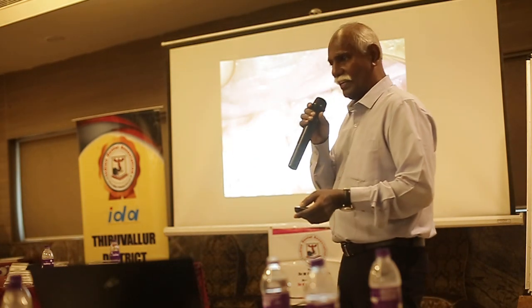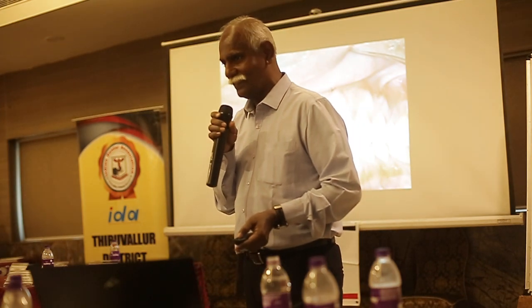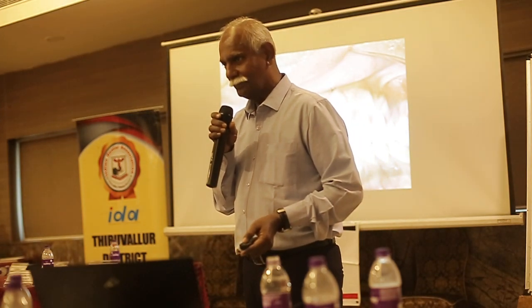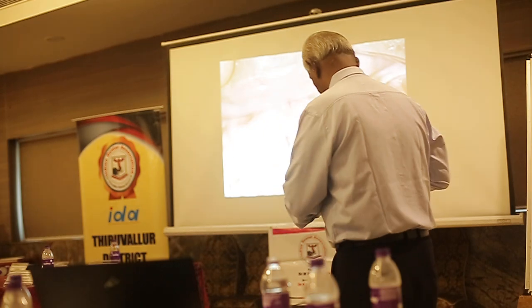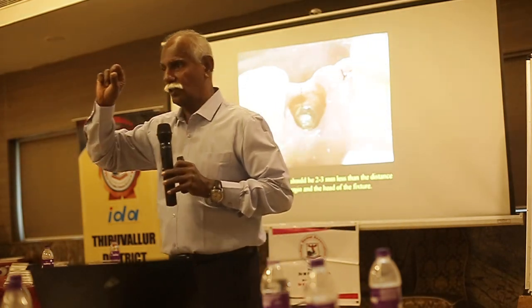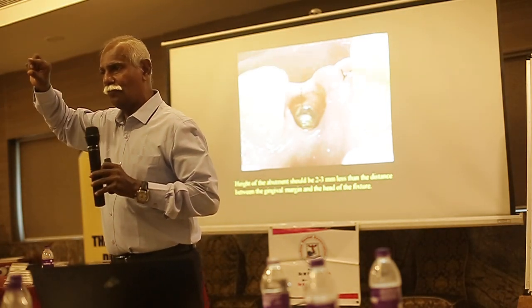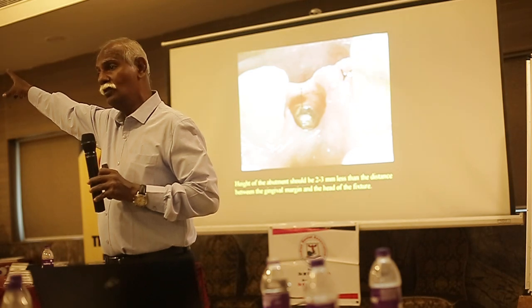So this is a clinical scenario. Again, what sort of abutment are you going to use? See the axis? Angulated abutment. Beautiful. Now the angulated abutments do have a collar. It starts from 2 millimeter, 3 millimeter, 4 millimeter. Some companies have up to 6 millimeter.